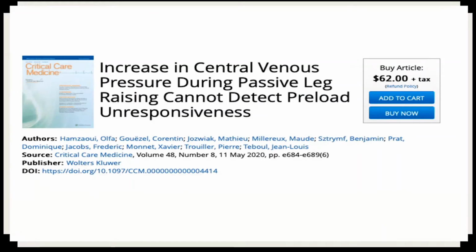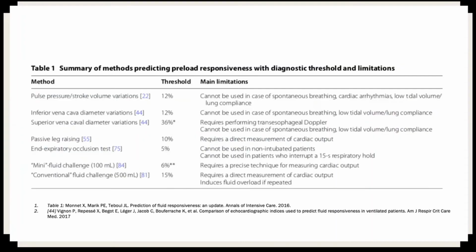And we also see an increase in central venous pressure. We cannot use static markers. They are out. In some of the articles you read, they actually ask you, please stop using static markers such as CVP and single-check ultrasound of the IVC for assessing fluid responsiveness. Now, the next step would be, where does IVC ultrasound fit in looking at whether a patient's fluid responsive?